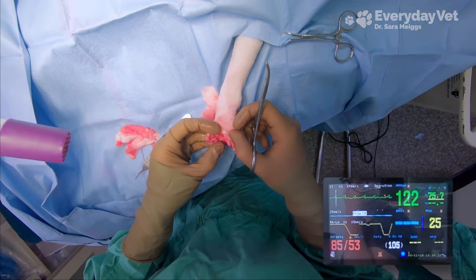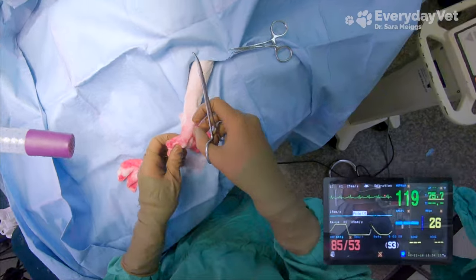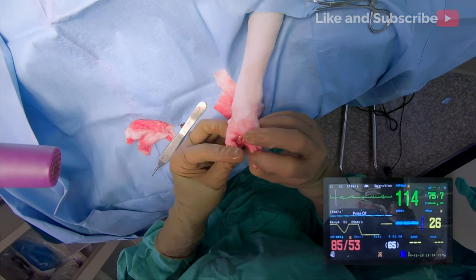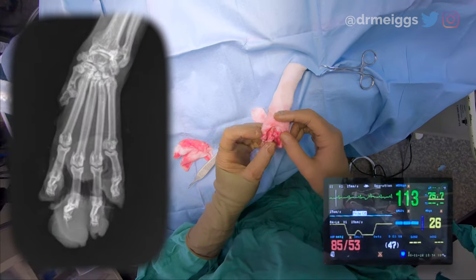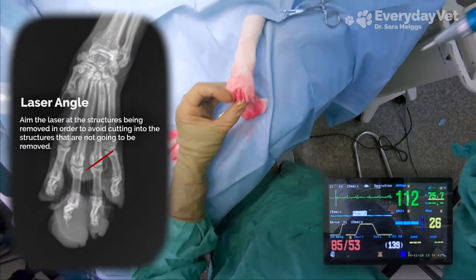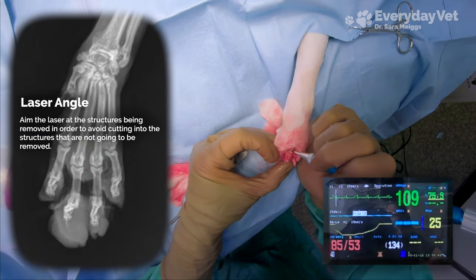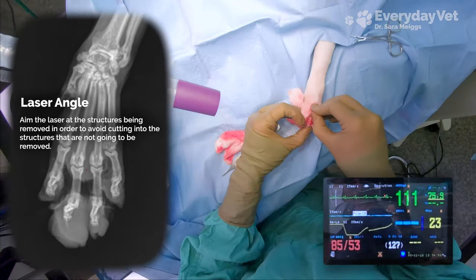Now that I've got that toe isolated from its neighbors, it's still attached at the joint because there's a tendon running along the top of it that allows it to extend the toe, so I'm going to have to cut through that. Then I can get down into the joint and disarticulate it. A general tip for any veterinarians or those looking to become one: you'll want to angle the tip of the laser towards the proximal phalanx. That way if you accidentally cut too deep, you'll end up cutting into the bone that's being removed anyway.